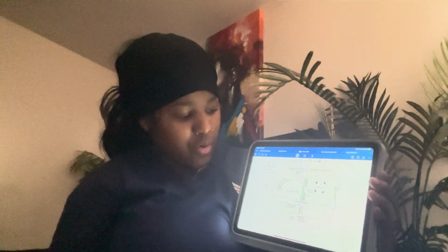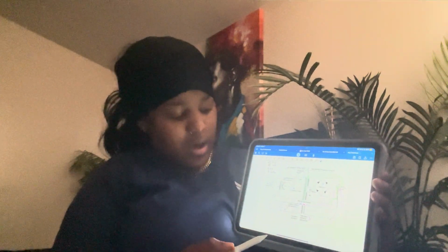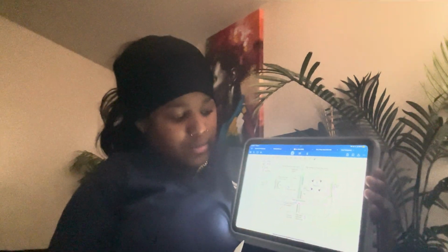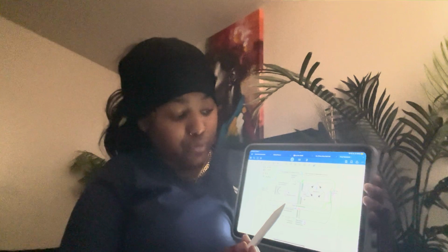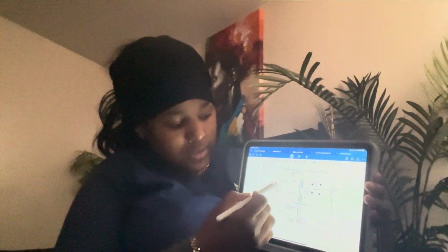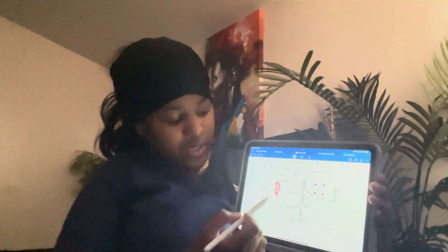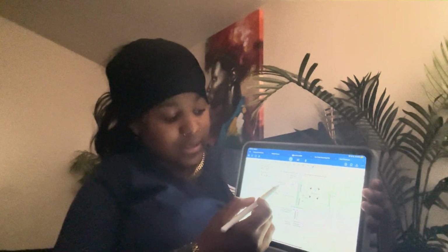So with the next thing that we have that's important, we have the auto transformer. The auto transformer is another important part of the X-ray circuit. It's positioned between the main power and the step-up transformer, and the high voltage transformer. The auto transformer consists of an iron core with a single winding, which allows the transformer to control the settings of the kVp.